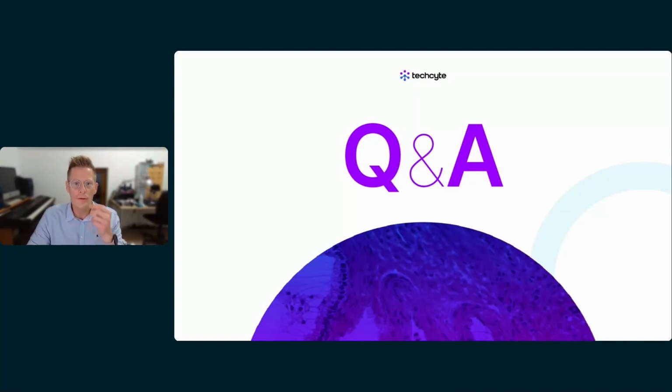So we've got a first question: is the AI continually learning and changing, or does the algorithm stay the same? It's actually a great question, because the short answer is yes, it is. And the AI, with every input, with every use, does enable us to revise the model.